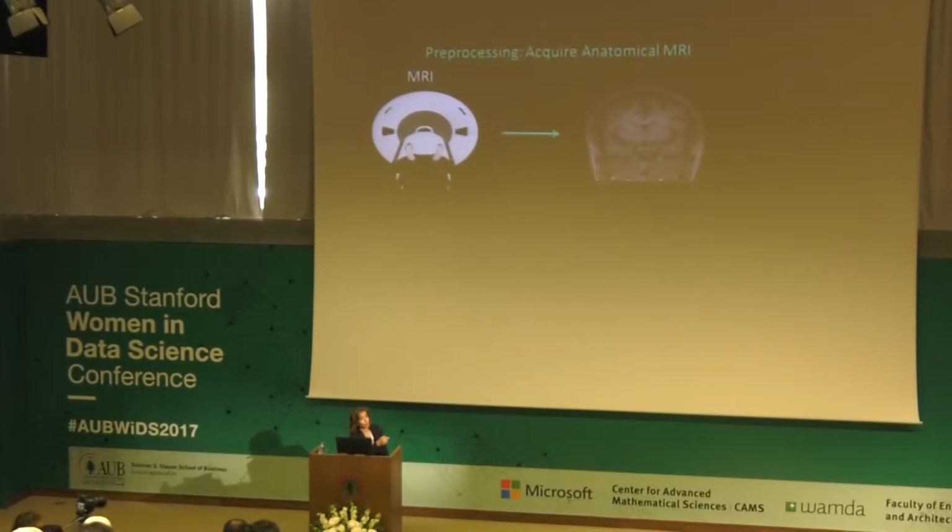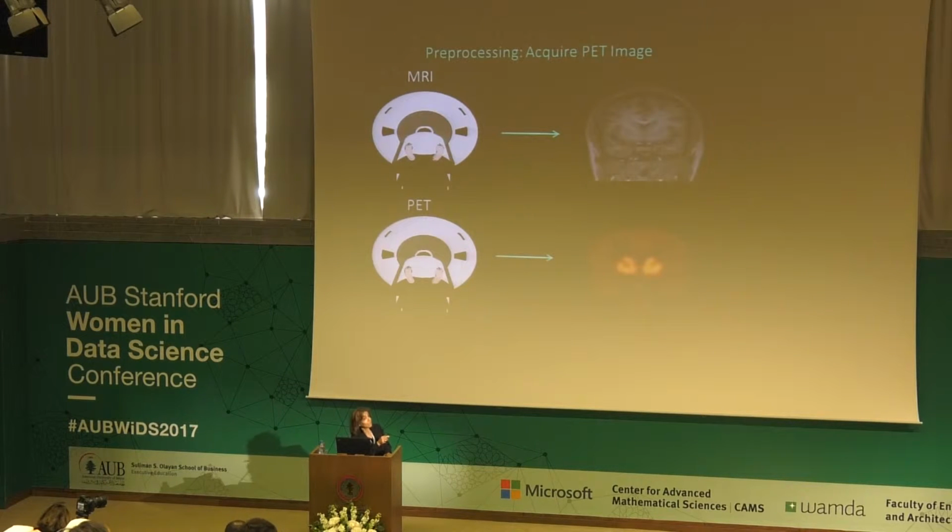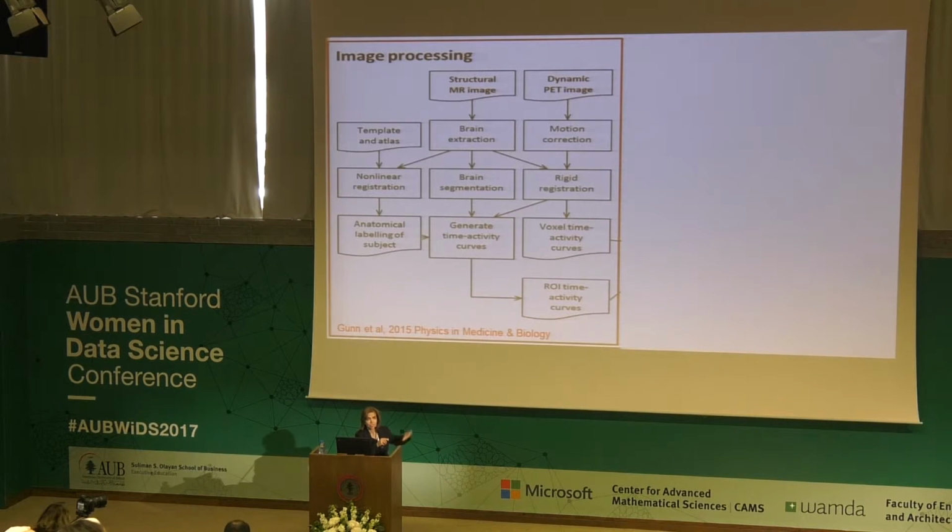And that's what he does, is process the data and analyze, or oversee a team of people who analyze the data. One particular initial point is how to measure the radioactive signal in the brain. First, we draw regions that we want to concentrate on that encapsulate the radioactive signal, and compare them to regions that have less radioactive signal. In order to do that, we have to get an MRI on the same subject.